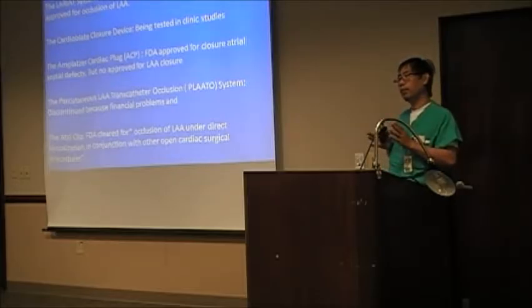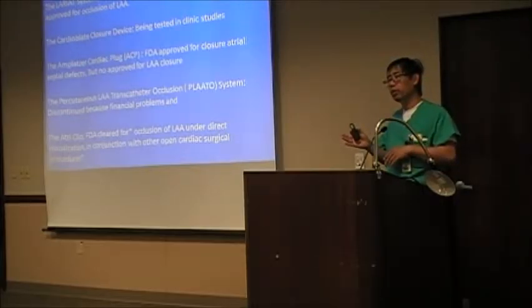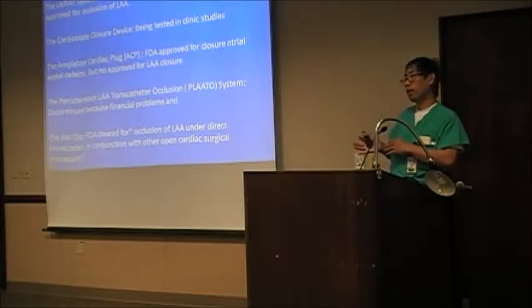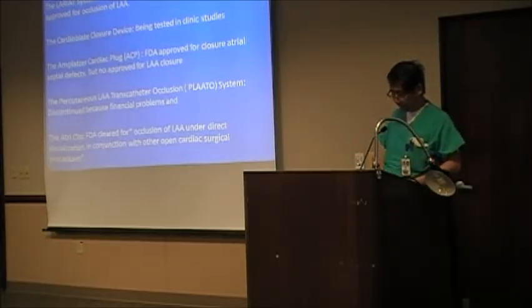But we have some people with bleeding on Coumadin who cannot take anticoagulation because of frequent GI bleeding and transfusions. They are all high risk patients. We sent them to Dr. Michael Brothers to get these things. So I will show you a couple of pictures.